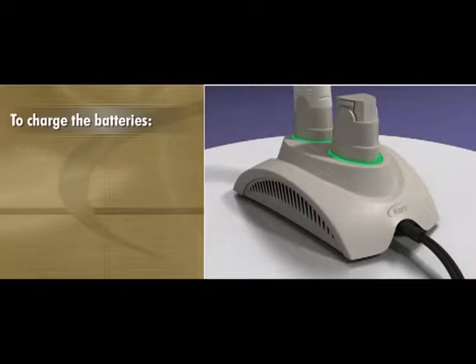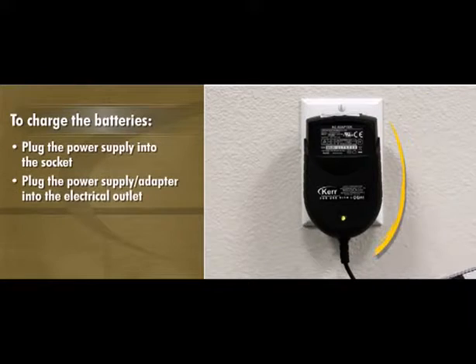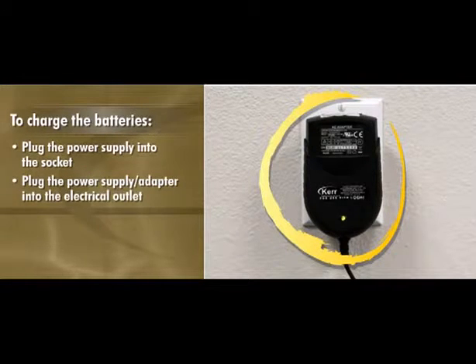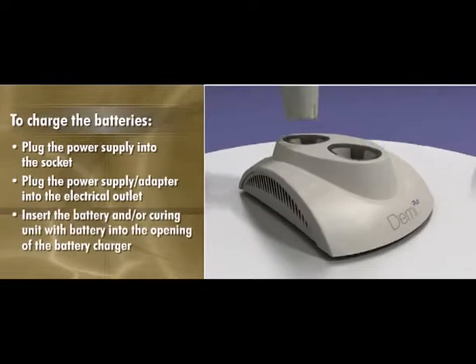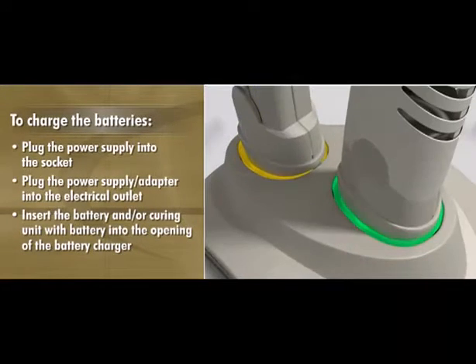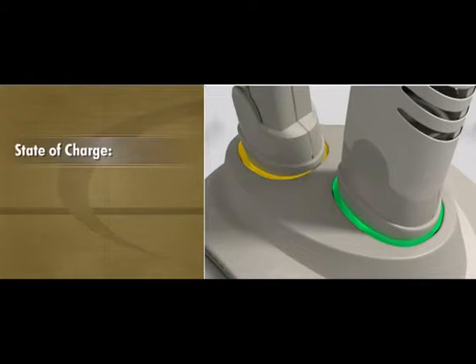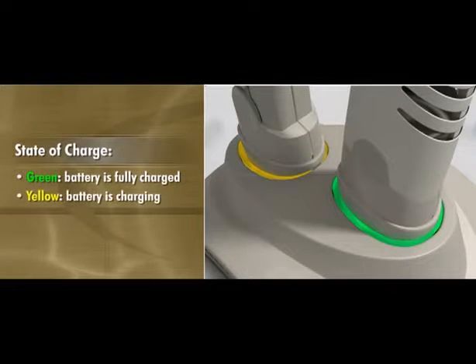To charge the batteries, plug the power supply into the socket located at the back of the charger base and plug the power supply adapter into the electrical outlet. Insert the battery and/or curing unit with battery into the opening of the battery charger. The lighted rings that surround the openings in the charger base indicate the state of charge for each battery. A green light indicates the battery is fully charged, yellow indicates the battery is charging, and a blinking yellow light indicates a fault condition.